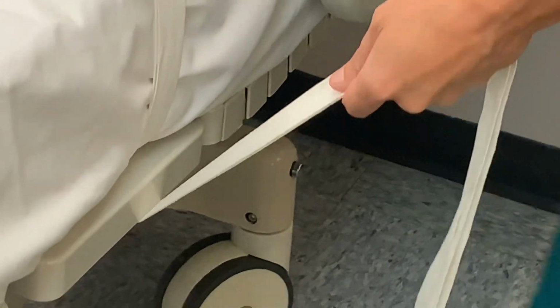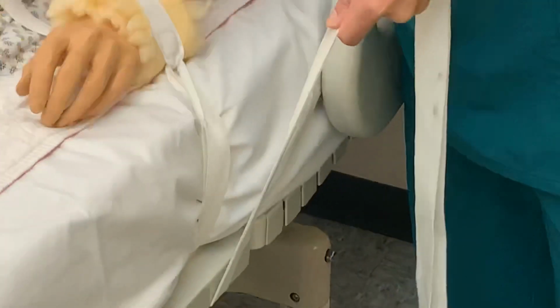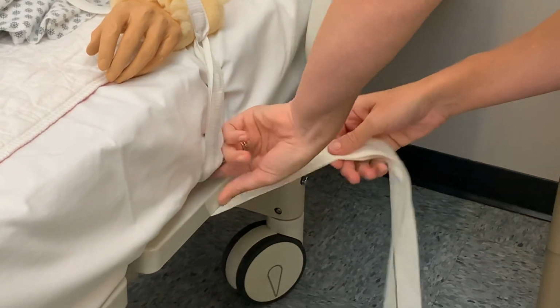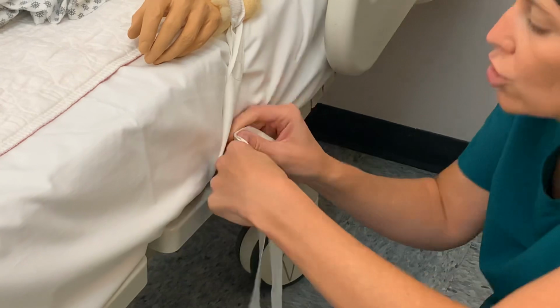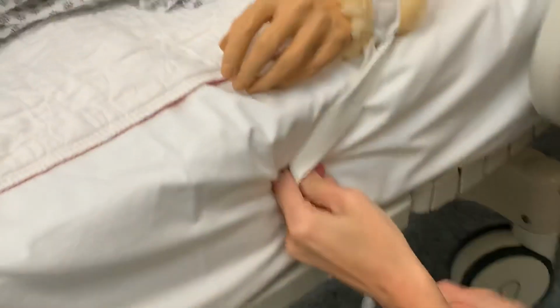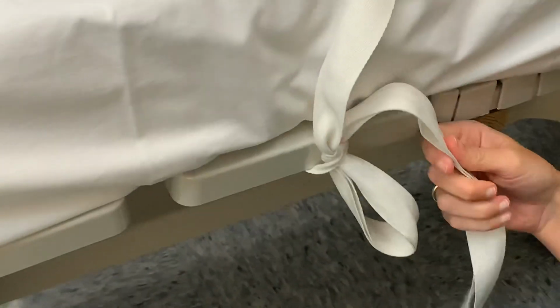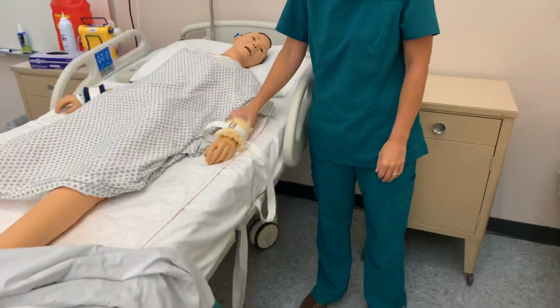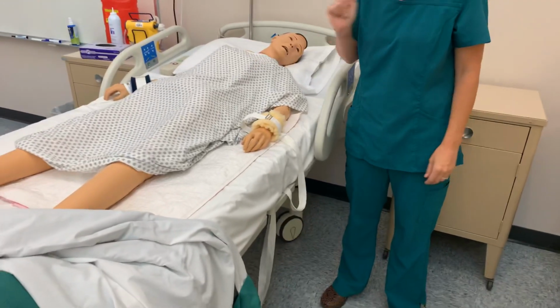So a slip knot is shown in your textbook. What I was talking about a while ago, let's say I don't want them to be able to lift their hand very high. I'll do that really tight like that. Come around and I just loop it. And then I secure, and there's my slip knot. And then I can immediately release it if needed, okay? Because you always want to be able to take the restraint out, release it just like that.